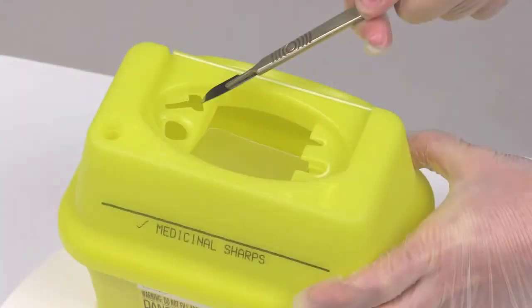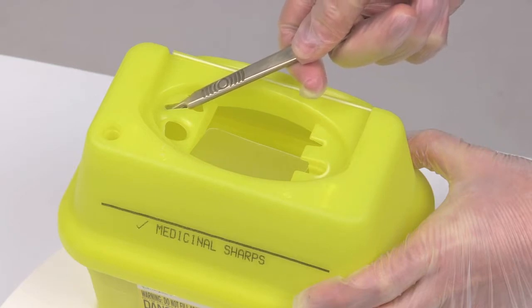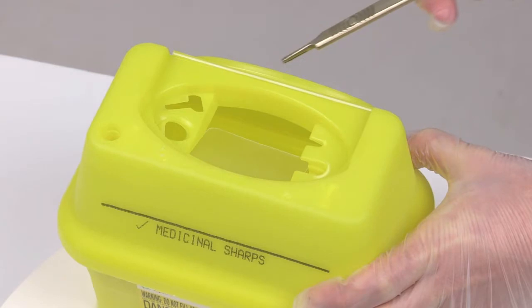Place the scalpel into the blade remover until a click is heard. Then, with the container held firmly, remove the scalpel handle at the same angle until the blade releases from the scalpel handle. Allow the blade to drop into the SharpSafe container.